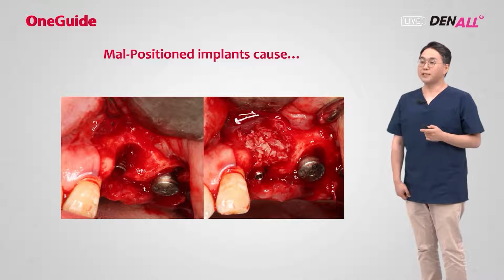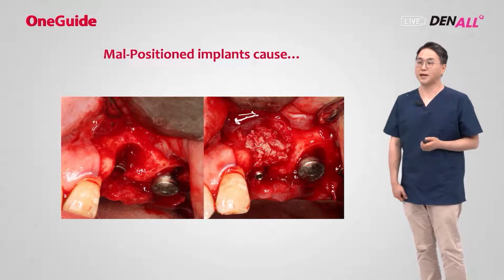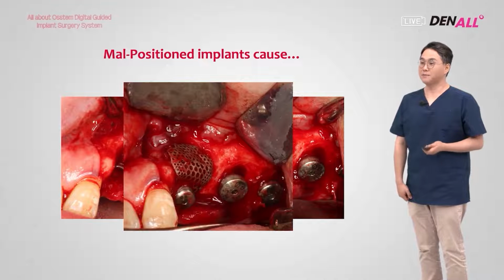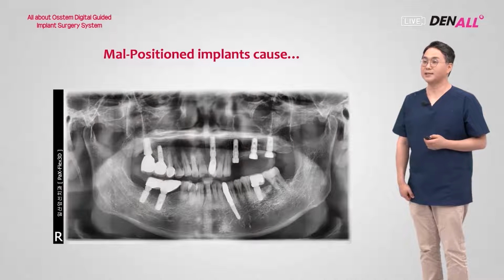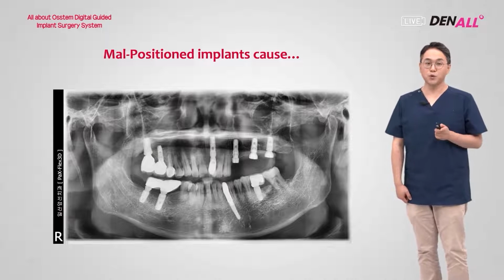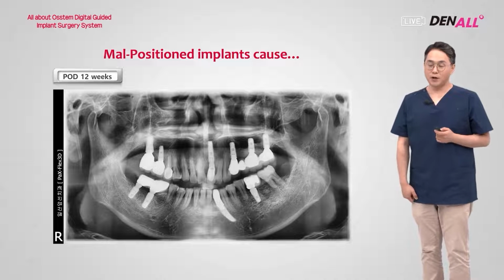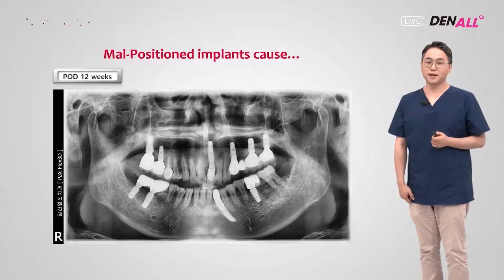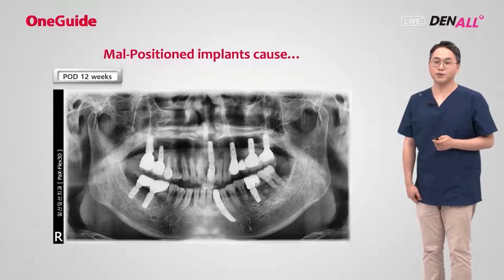As you can see, at number 24, there was continuous peri-implantitis and buccal bone loss. In order to regenerate it, allograft and OSSTEM OS builder were used, and transmucosal GBR was done. Surgery was complete. Let's look at the panoramic image. Mesiodistally, the implant was placed very nicely after the final prosthesis. Mesiodistally, the implant was placed very well, so the implant is positioned at the center of the prosthesis.